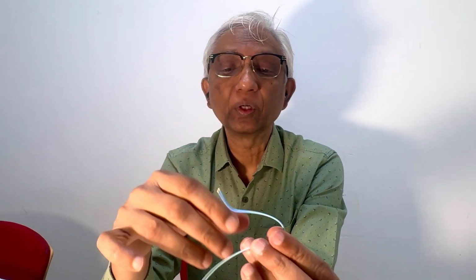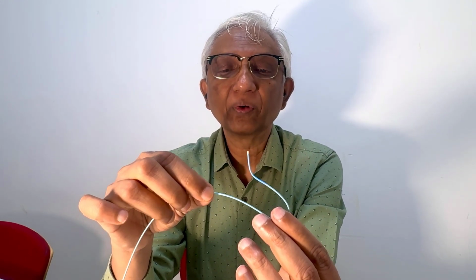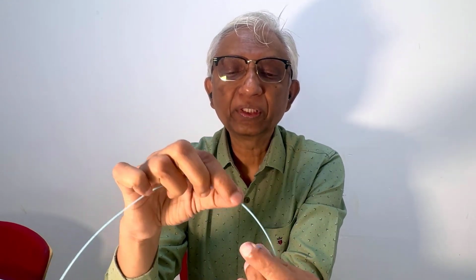I hope you understand. So remember that for all people who are doing neuro work, you need to have the Simmons, because without this, you cannot engage carotids in an unfolded aorta. So remember, making a curve in a Sim 2 or a Simmons 2 is more difficult. You go right into the aortic valve and you push the catheter, it will come like this. As the tip touches the valve and you push it, it will go like this.